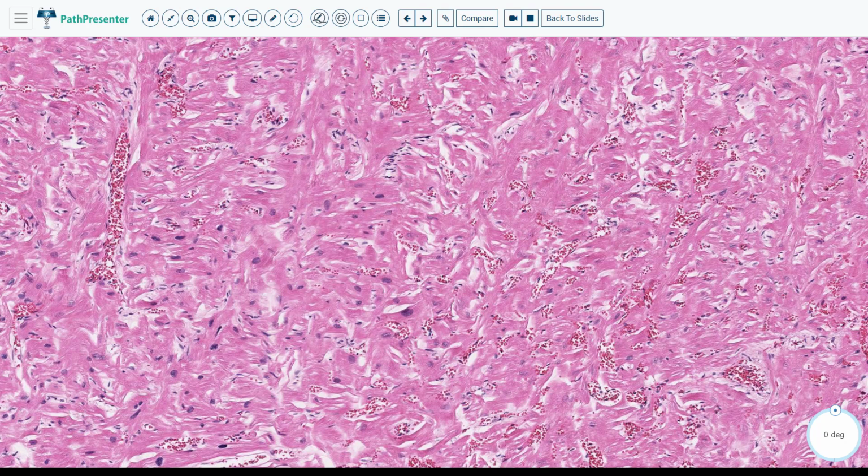Hypertrophic cardiomyopathy is autosomal dominant and can be caused by different mutations of sarcomeric proteins. These mutations cause enhanced contractility with impaired relaxation, and the myocytes respond to the abnormal function with hypertrophy. You can also get fibrosis. If you did a trichrome stain, you could probably see the fibrosis in this case.